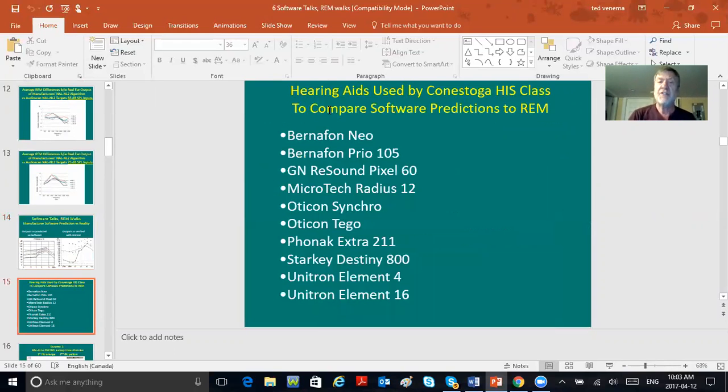Let's just look at some case studies here. These are results from a few years ago, from a project I had students do in the real ear class at Conestoga College in Kitchener, Ontario, Canada. That's an HIS program that I had started there. None of these hearing aids even exist anymore.